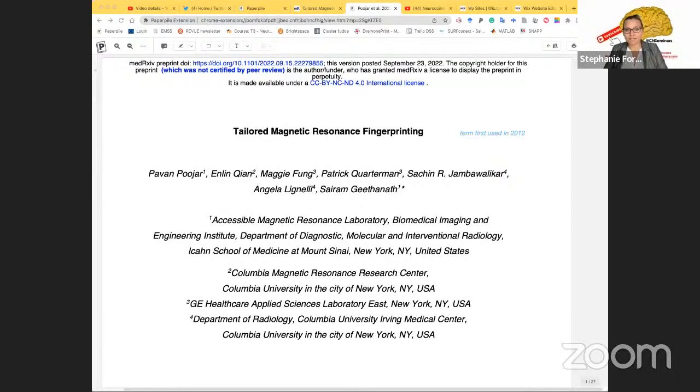Now, in terms of the methods, the qualitative images were reconstructed and denoised using a deep learning algorithm and gradient anisotropic diffusion denoising, and the quantitative tissue maps were reconstructed using a dense neural network to speed up the process. And then in both types of scans, the gray and the white matter tissues were segmented semi-automatically.